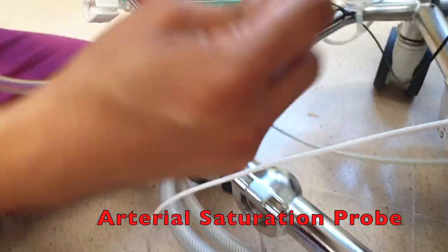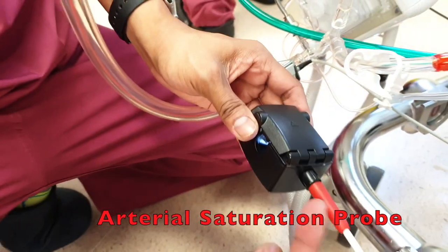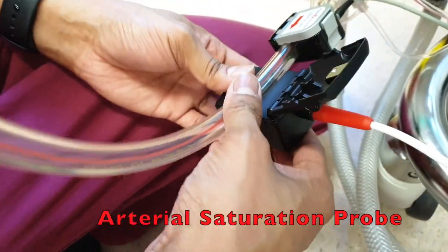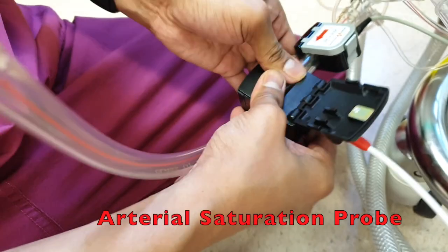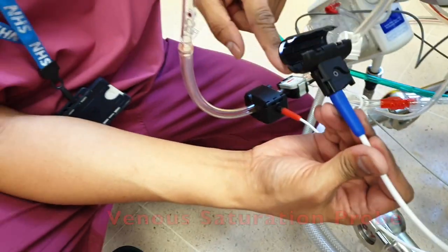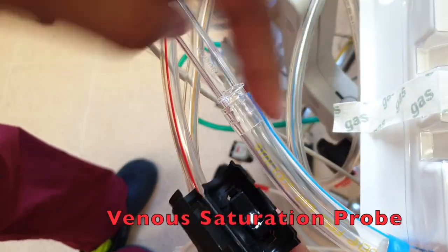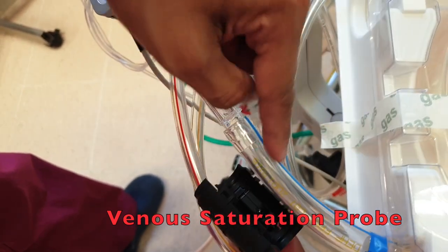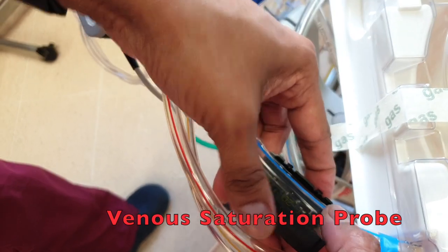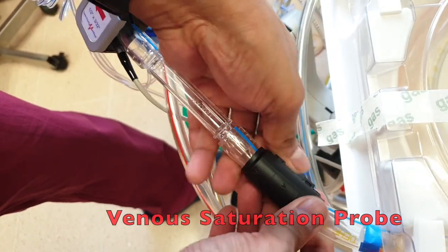Arterial saturation probe. Yeah, this is arterial, the red one. So we put it here. And then this other one is the venous saturation probe. Just mind the light. See that light? It shouldn't hit the blue, the colored part. Same with that arterial. So make sure it's on the clear part. So yeah, it's there.